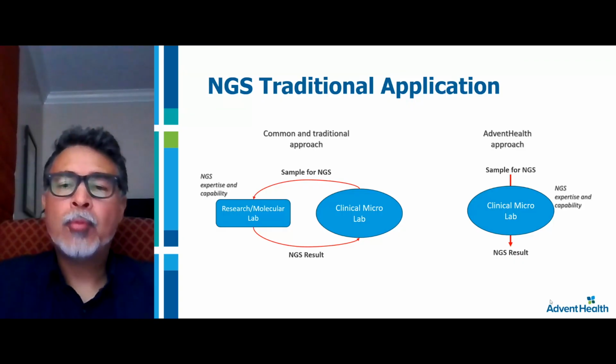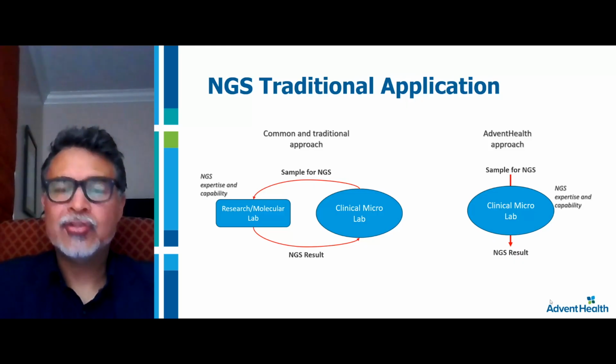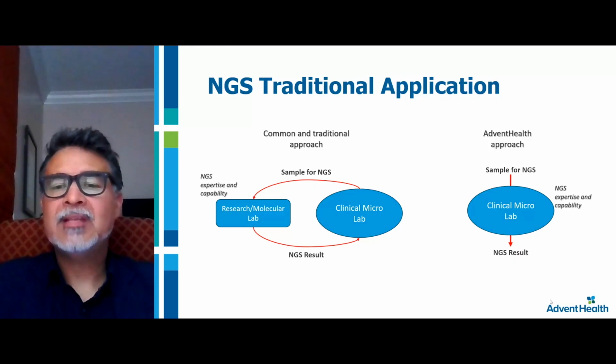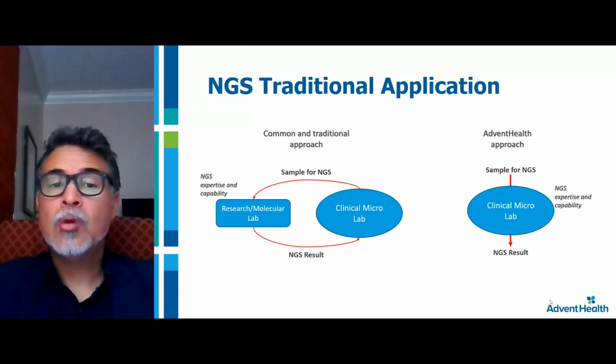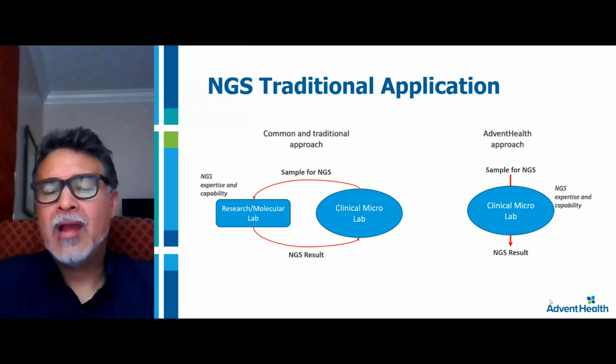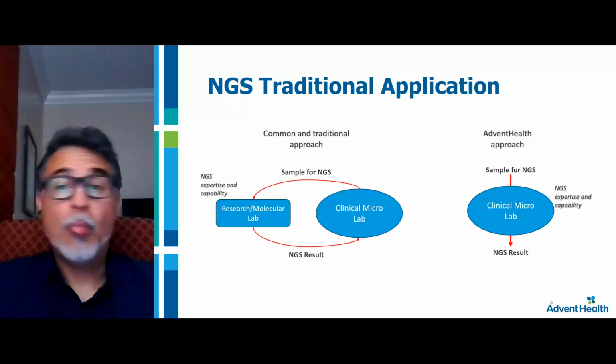The approach that we have at AdventHealth was that we need to have this expertise and capability inside the clinical microbiology lab. We needed to make sure that this test is done by clinical laboratory scientists. They understand microbiology. We take NGS as an application, as a diagnostic tool, not as a specialty. Just like we have expertise in MALDI-TOF, in susceptibility testing, in multiple immunological techniques, NGS was one more of those techniques.